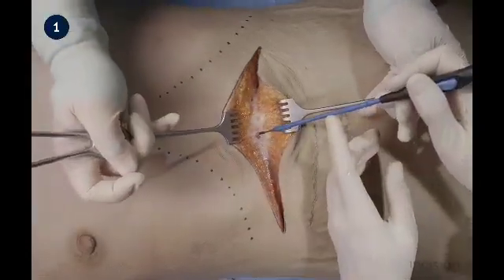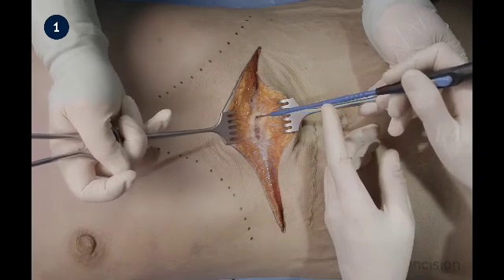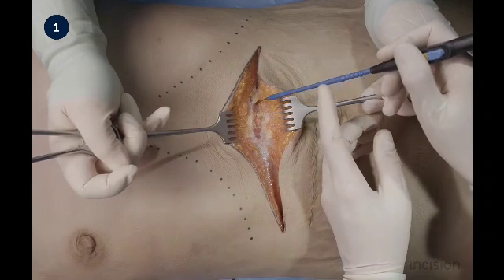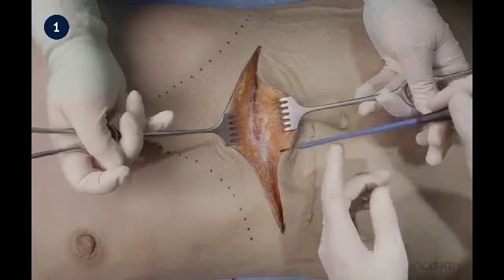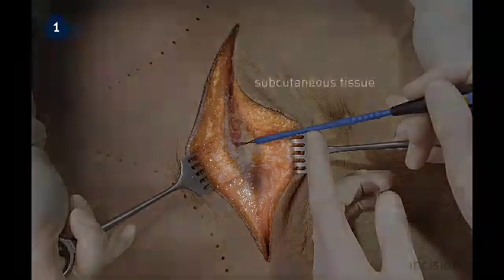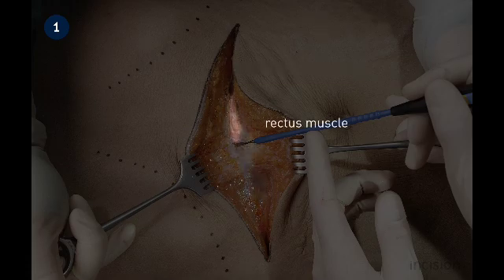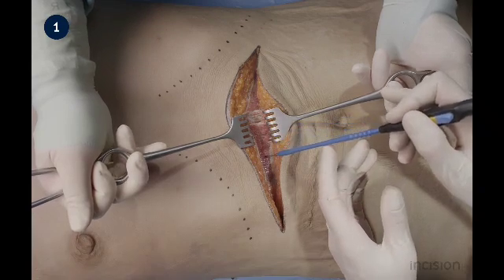In this film, we start the incision of the anterior rectus sheath in the midline, at the level of the linea alba. Here, an overview is shown of the subcutaneous tissue, the anterior rectus sheath, and the rectus muscle. Transection of the rectus muscle is performed.